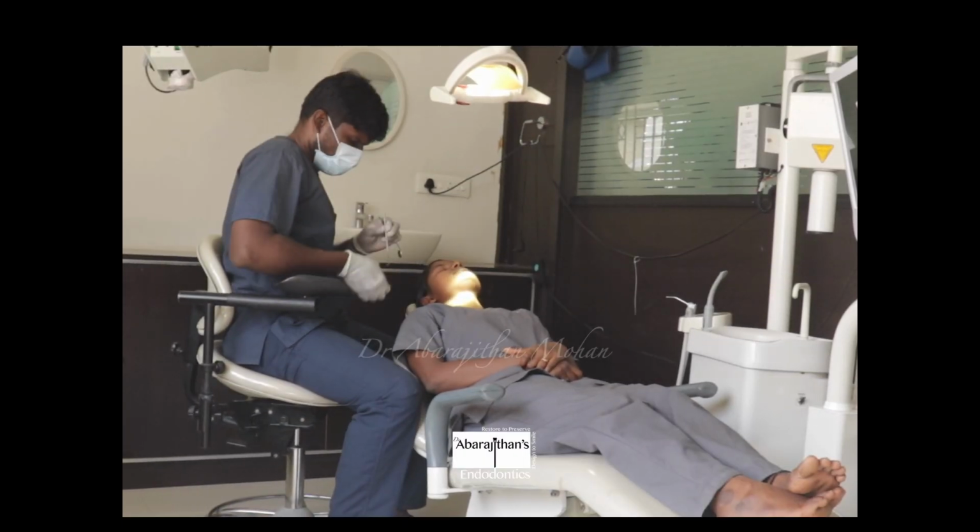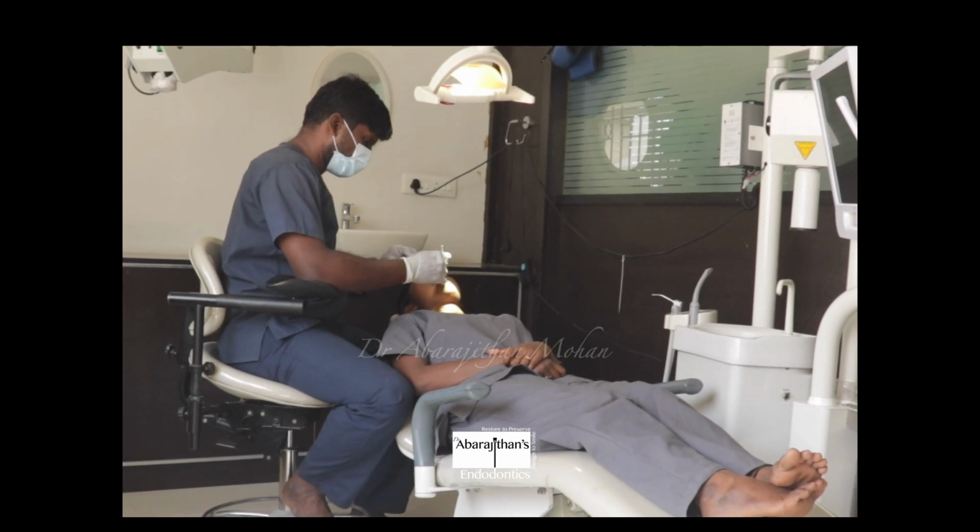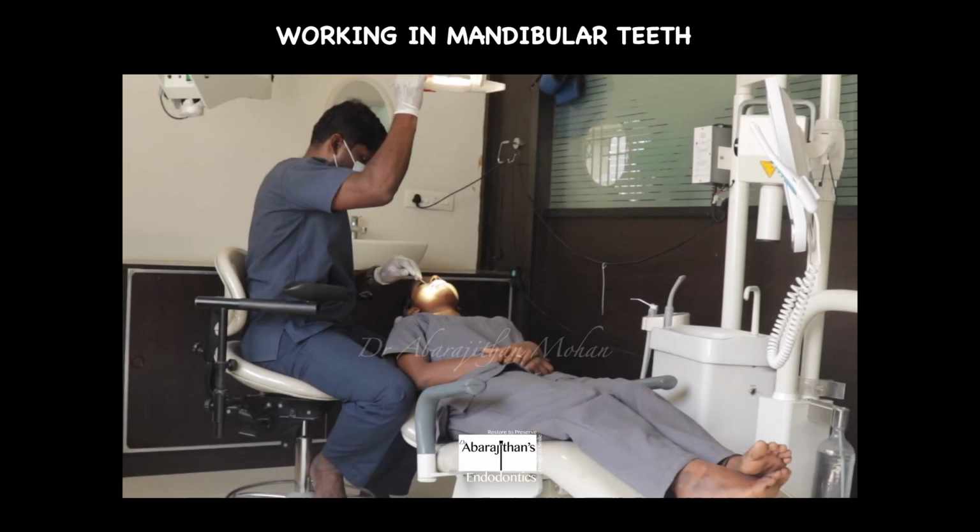So as you can see here, we are going to adjust the dental chair in such a way that when the patient opens the mouth wide, the mandible is parallel to the floor and the operator is going to have a good direct vision.